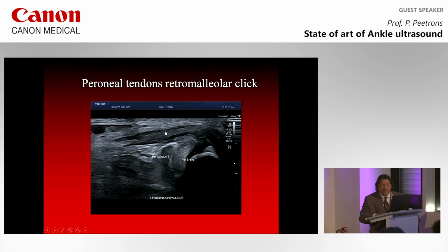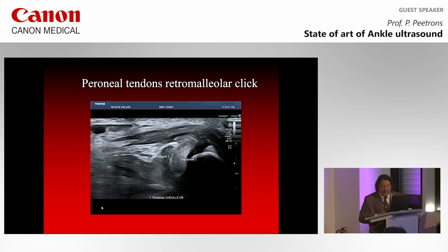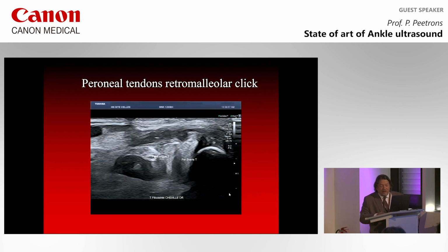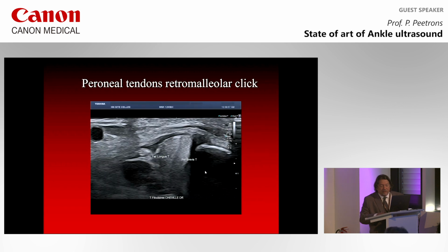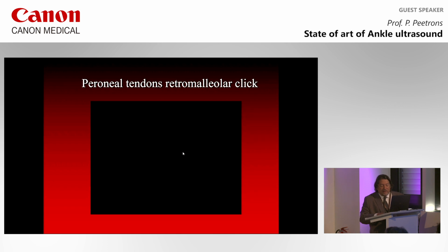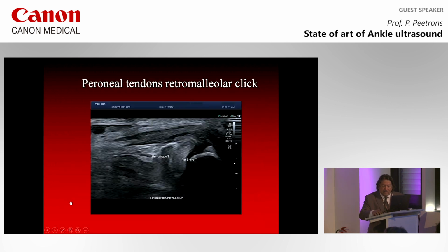picture, you can see that the retinaculum of the peroneal tendons is much bigger than normal. Normally, you have a very fine line with a little triangle here. In this case, you don't have this. You have the peroneus brevis and the peroneus longus tendon together, and what you'll see when the patient is asked to do the click is that the peroneus longus and peroneus brevis are turning around each other. So longus is there and brevis is there. And you can see it again, once again.